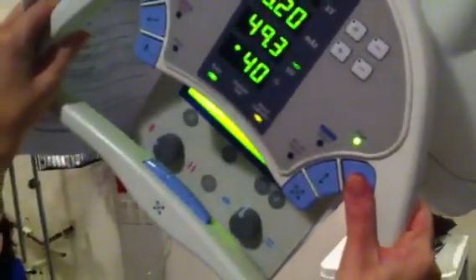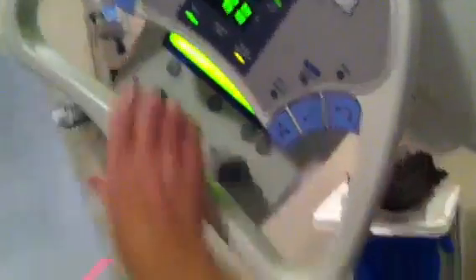You will angle 40 degrees cephalic. This is tabletop, not in the bucky. Your central ray will enter midline of the plantar surface of the foot at the base of the third metatarsal.